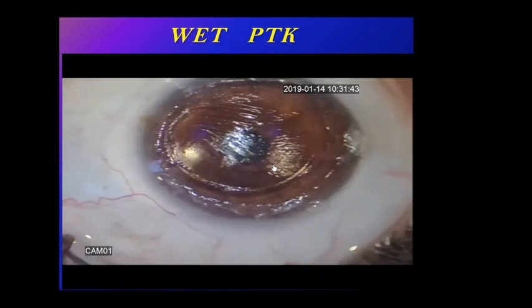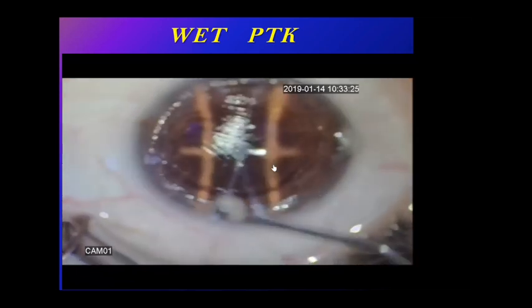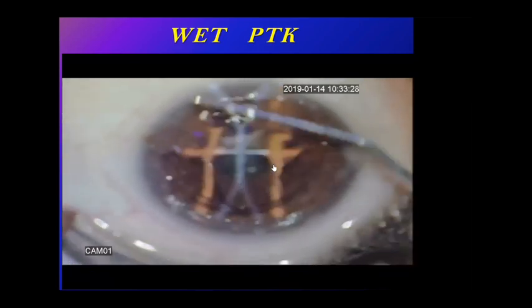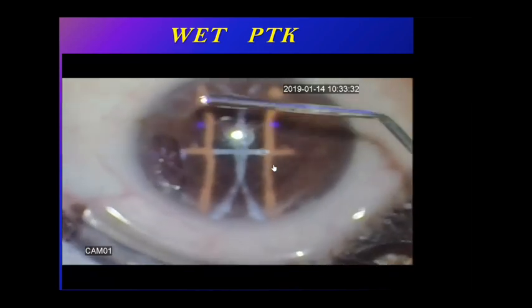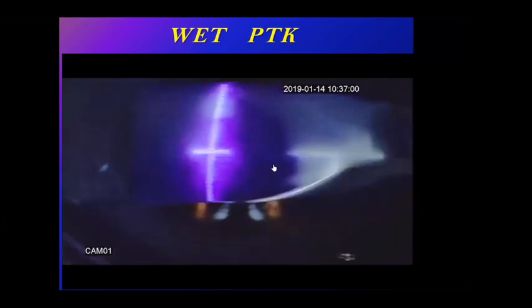So if we look carefully now, try to remember the shape, because it will be a different shape in less than a minute. We are shooting on the fluid. How do you know, in the fluid, that we should not see the black spot, which means that we reached the stroma? Once we reach the stroma, we put another fluid. We induce the effect on the fluid. You see that? The sponge is full of fluid. I'm just putting a new layer. I don't want to reach the stroma. It's just on the fluid.